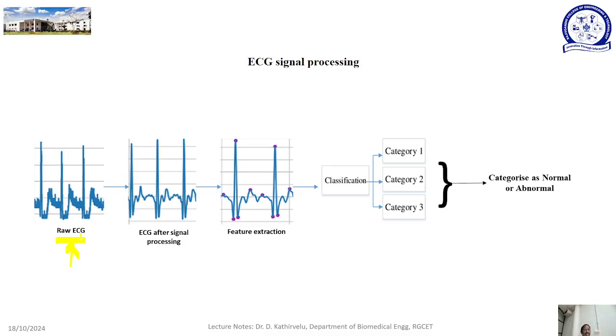the ECG pattern. So the ECG in its raw form has the original ECG embedded with noises due to various factors like motion, environmental factors, or improper fixation of electrodes. Before it is presented to the cardiologist for further diagnosis, we have to ensure that all the noises are removed. It is denoised and presented in its pure form to the cardiologist.